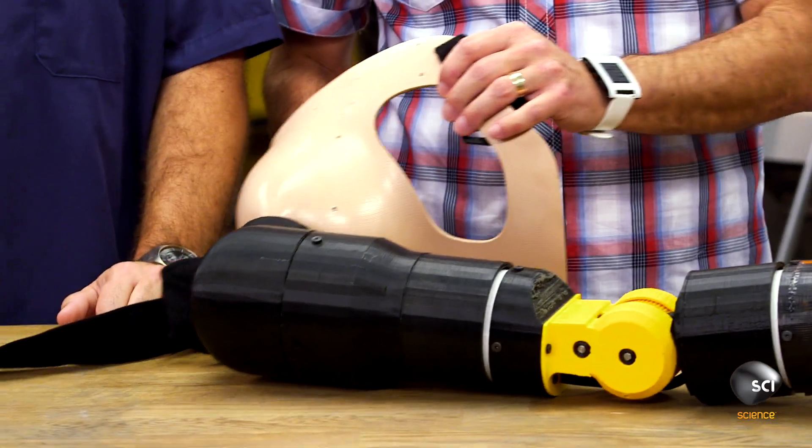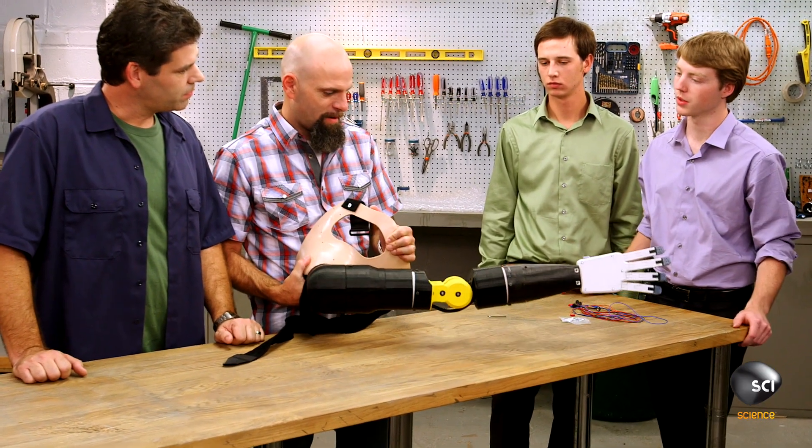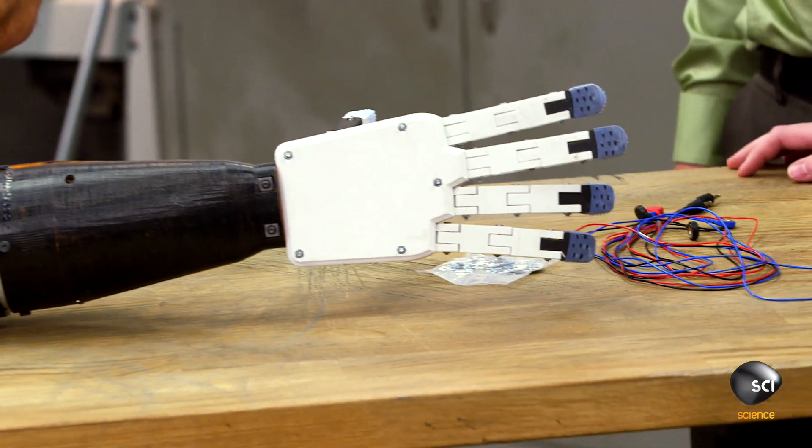How much does this weigh? It's actually under 10 pounds. That was a big goal of mine coming into this. The human arm weighs right about 10 pounds, and for a prosthetic, that's really the line right there — you don't want someone walking around with 50 pounds hanging on one side.